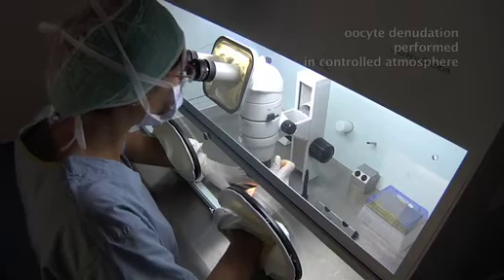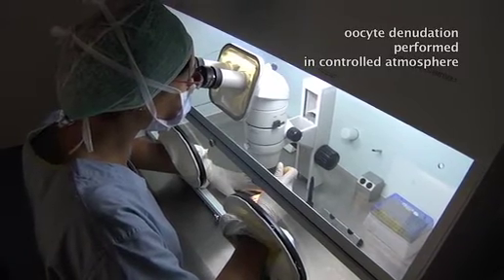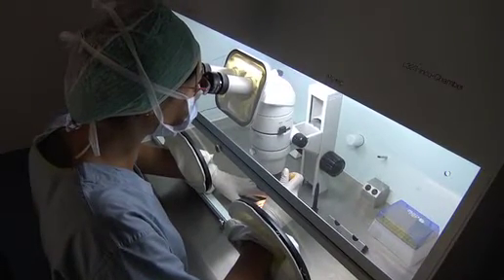Just before micro-injection, the oocytes will be denuded, which means that the cumulus corona cell complex will be exposed to an enzyme, the hyaluronidase, and then mechanically manipulated. This will aim to remove all the cells surrounding the oocytes. Here you can see oocytes surrounded by the cumulus corona cells — in this moment they are exposed to the enzyme, not longer than 30 seconds.